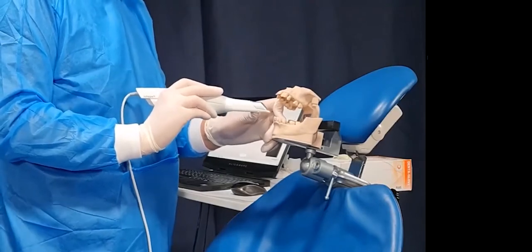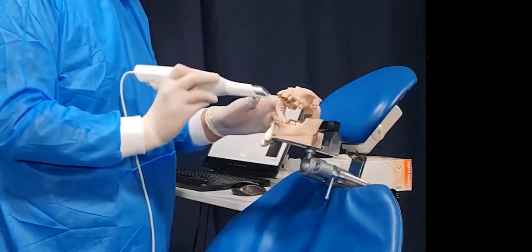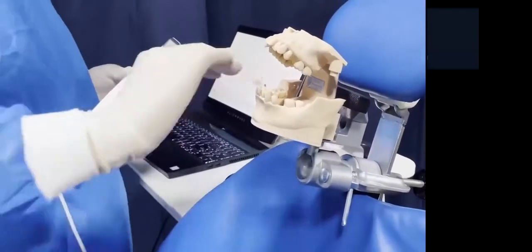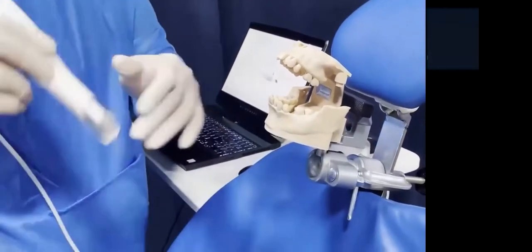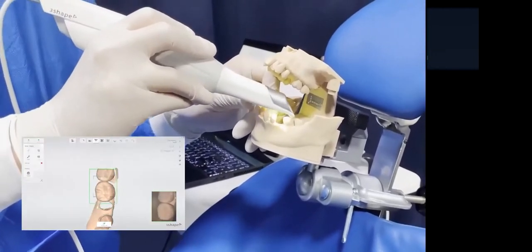Now we talked about it last week, how important it is, because we're going to be doing some fancy and funky moves here all over the shop, and that pivot point becomes very, very valuable for you to access those undercuts. So my scan is still running, and don't be scared to leave it running. It's not the end of the world. Let's jump into it, right? Enough talking. So I'm just going to look at the section that we're working on here.